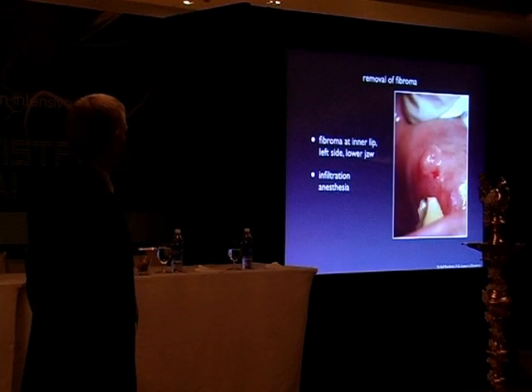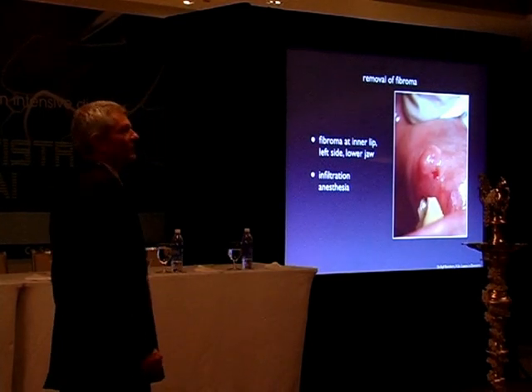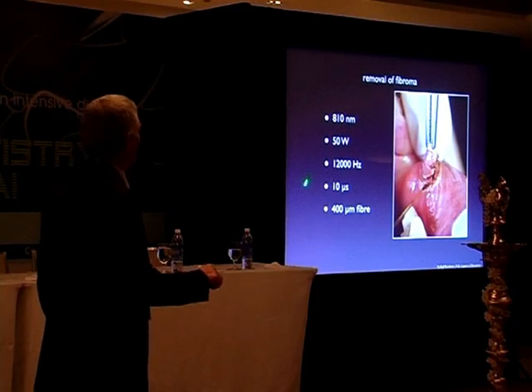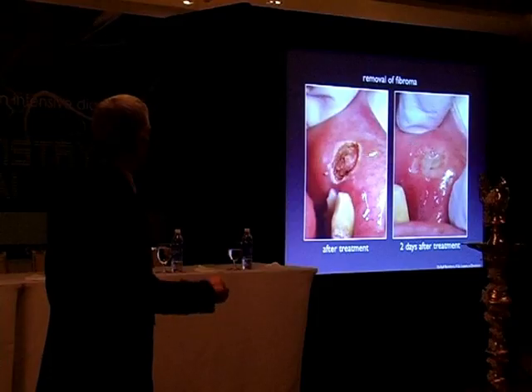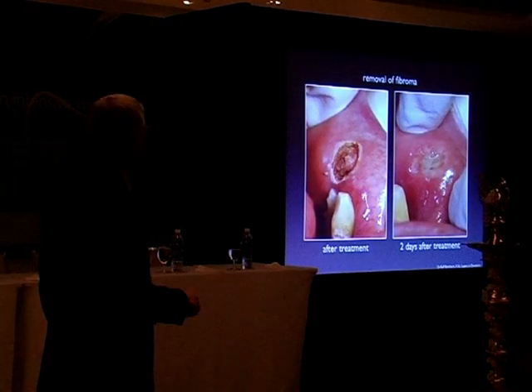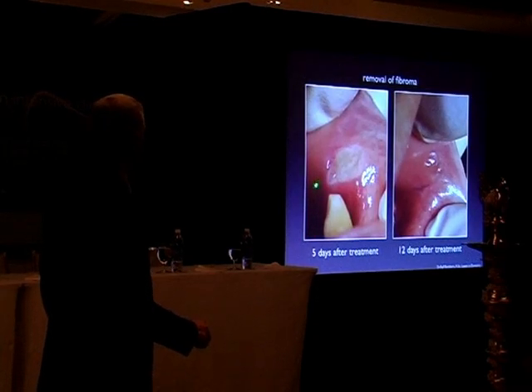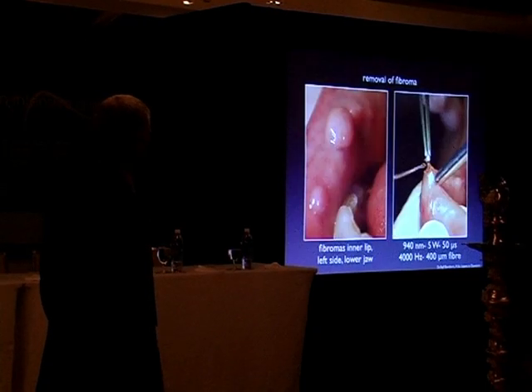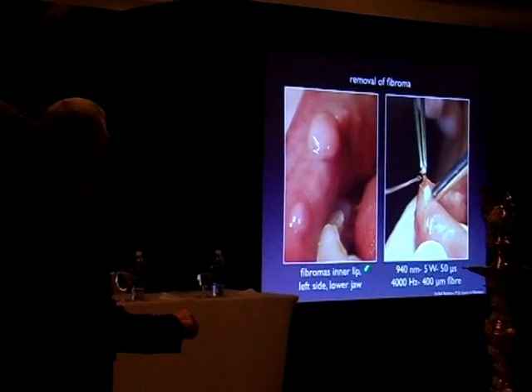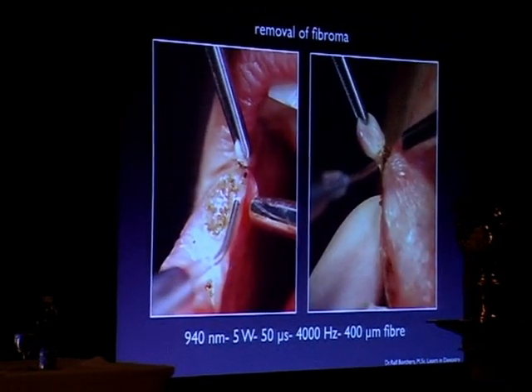10 days after surgery. This is a fibroma, a very big one at the inner lip, and it's treated with a very powerful diode laser with 50 watts, with a very, very short pulse. You can see it here, it's a little brownish afterwards, but it reaches very deep. This is 2 days after treatment with a fibrin layer on it, 5 days after treatment, and 12 days after treatment. This is a row of fibromas treated with a 940 with 5 watts, so only a tenth the power.